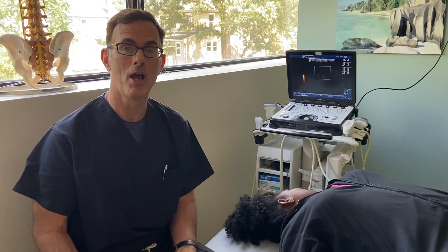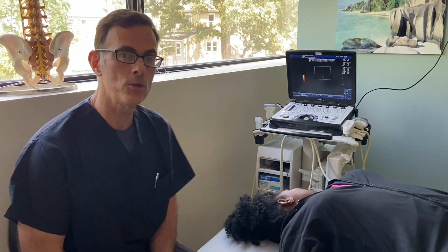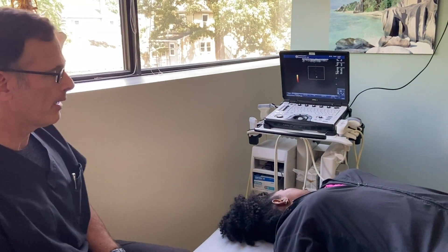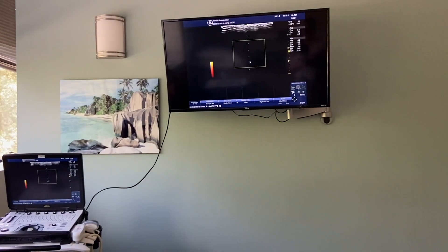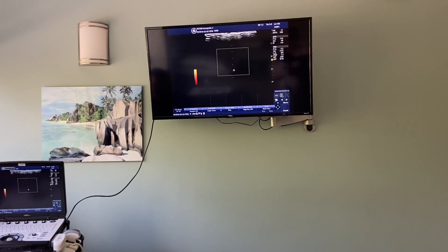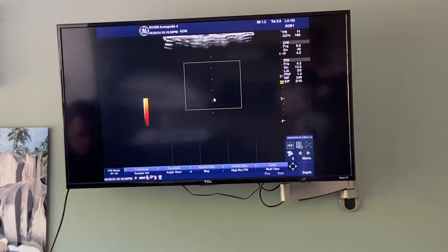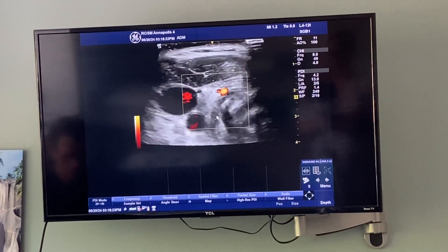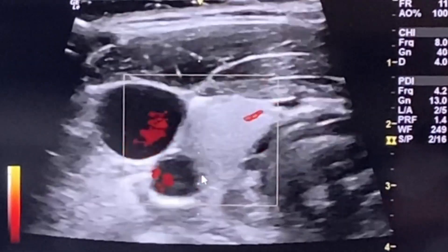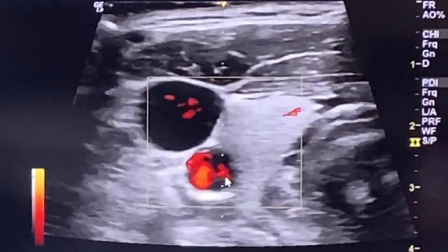In this case, a picture is worth a thousand words, so I'll just show you what I'm talking about. I use ultrasound with Doppler imaging, which allows me to see blood vessels in the area where I plan to go and where my needle will be directed. By doing that, I can ensure that I have a clear path to the target.